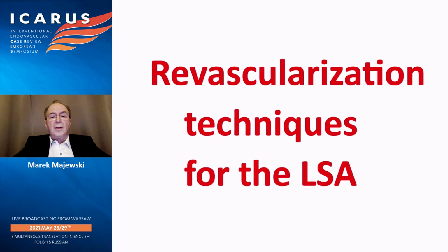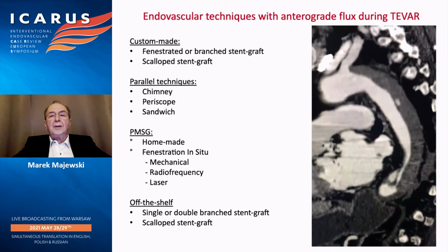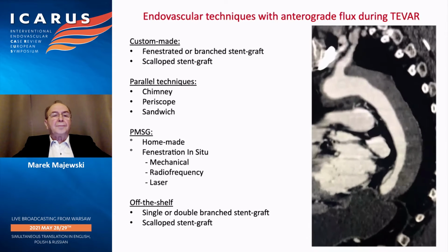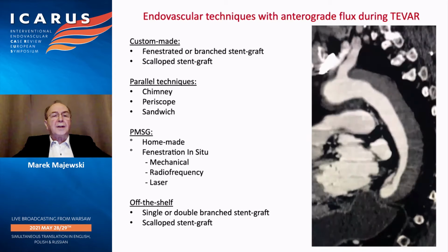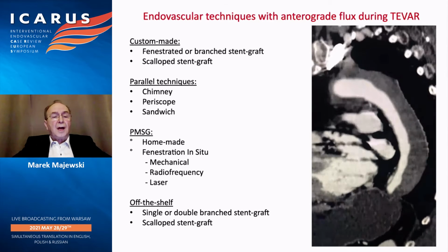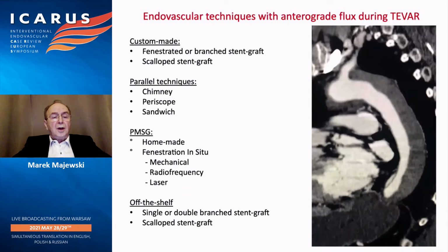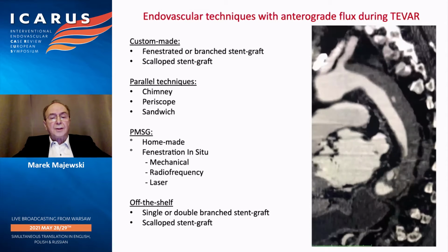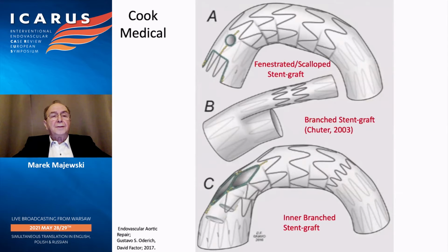Revascularization techniques for the LSA: transposition of LSA and LCCA bypass, endovascular techniques with antegrade flux during TEVAR, custom-made fenestrated or branched stent graft, scalloped stent graft, also parallel techniques: chimney, periscope, sandwich, and homemade fenestration in situ: mechanical, radiofrequency, laser.